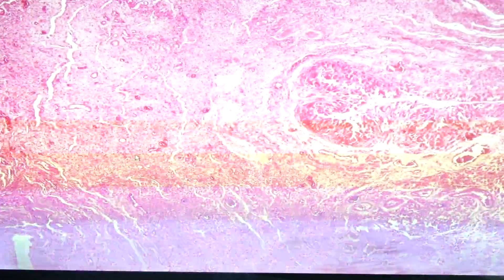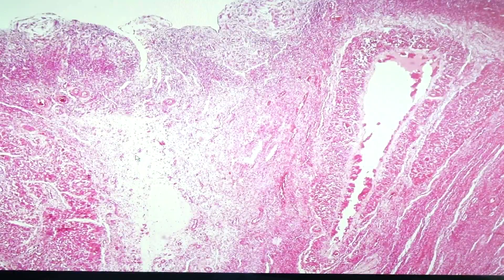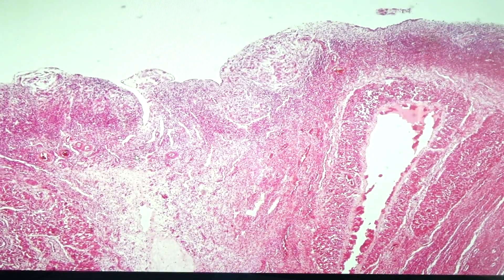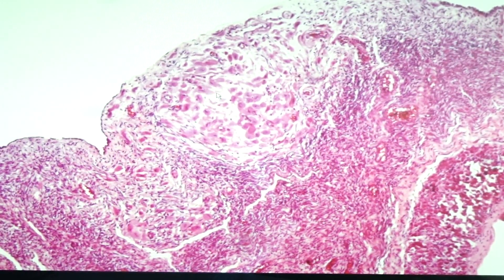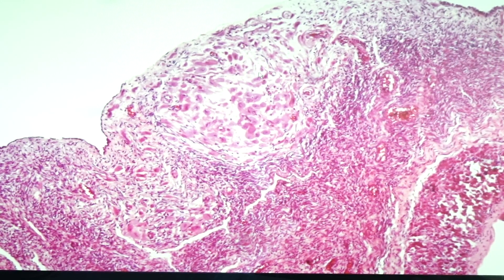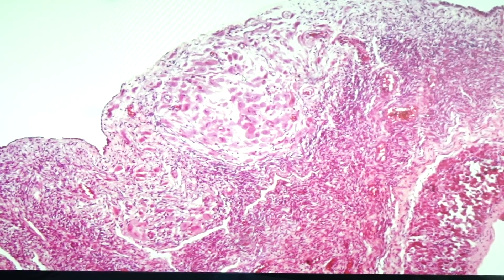The reason I think this is coming from a pregnant patient is because of the presence of these cells which are called decidual cells.